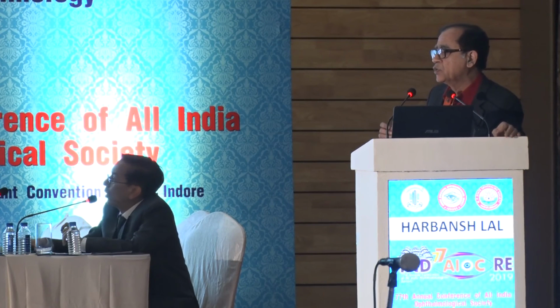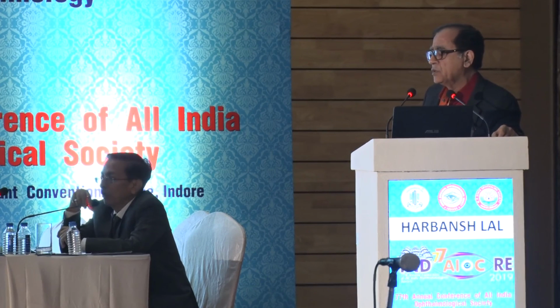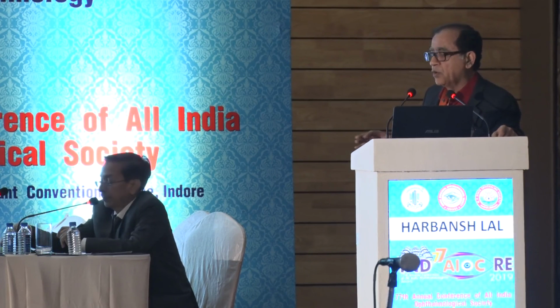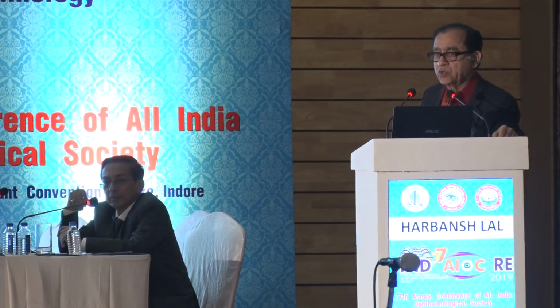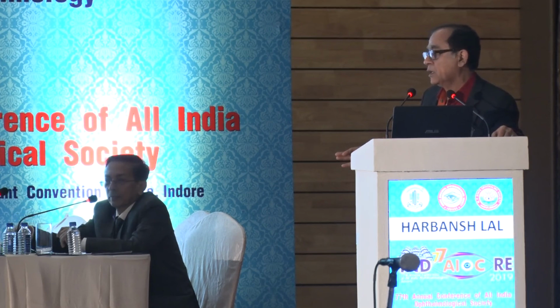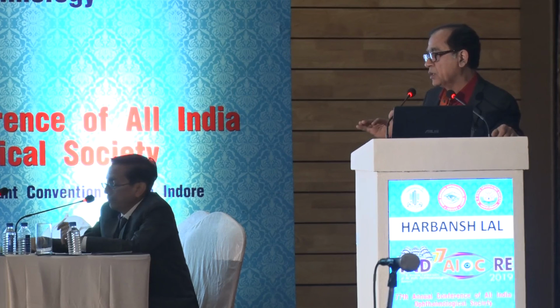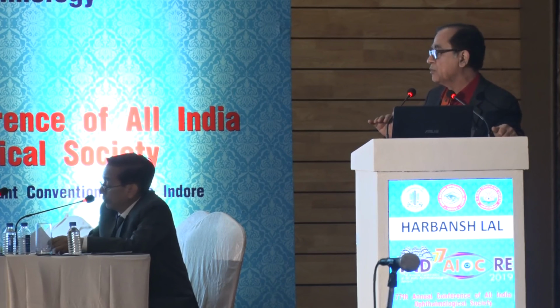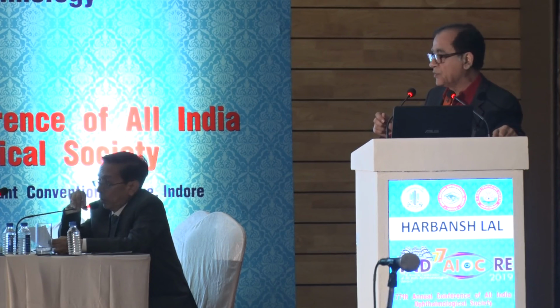And this instrument, for that, femto will be more ideal, definitely too costly, but femto will be more ideal. Yeah. So there will always be a case for the femto, there will always be a case for a Zepto. Like in those two cases I have shown, femto will not work and neither will the manual work so well. So these were two cases where the Zepto was excellent. Zepto needs a little more refinement, there is no doubt about it. There are certain problems in this sense because the neck is very weak and the centration at times is difficult. Okay.